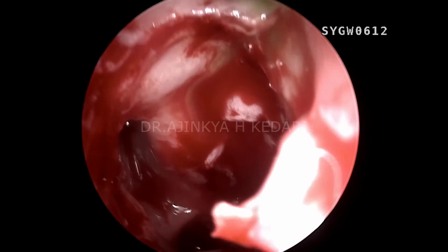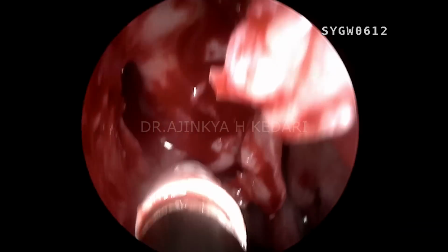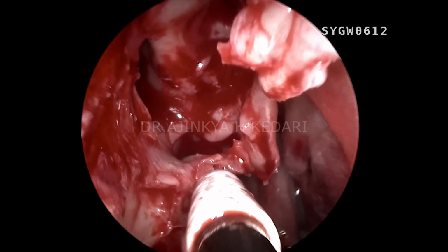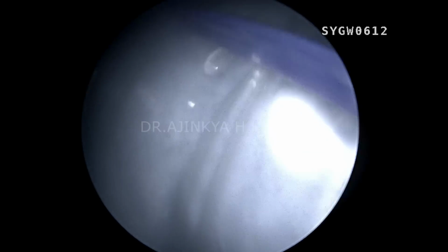I've always done that previously in my surgeries as well. I've used middle turbinate fascia as a free fascia graft for many CSF and skull-base tumor cases, to seal the leak and any skull base defect. So you can see I have a huge area inside to work.